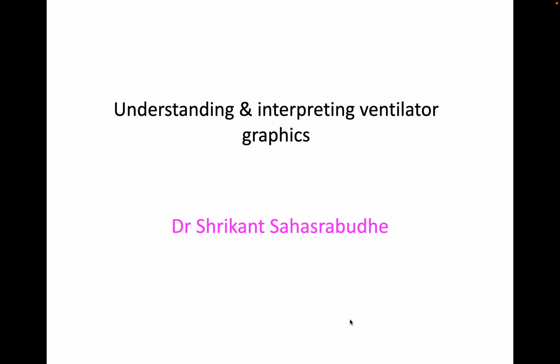And of course, for the exam going students appearing for IDCCM or DrNB or DM, we have a table with the questions on ventilator graphics. So without further ado, let us start.